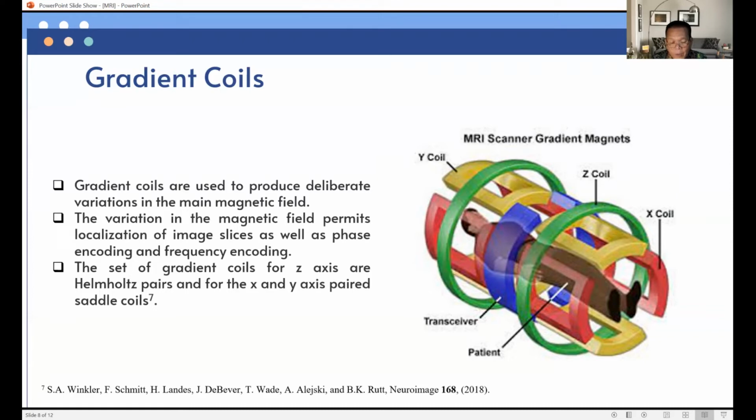The power supply is connected on either side of a short heated segment of the coil, and the current to the coil is gradually increased over several hours until the desired magnetic field is reached. The heated segment is allowed to cool to superconducting temperature, and the power supply is removed and taken away. The current continues in the closed loop of the coil for years without significant decline. A resulting property is that the magnetic field is always present.